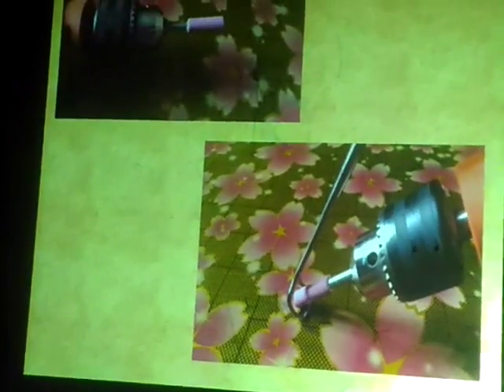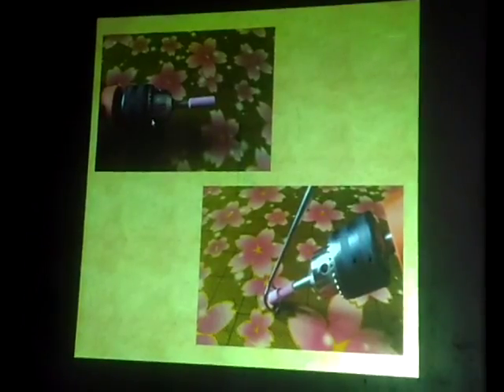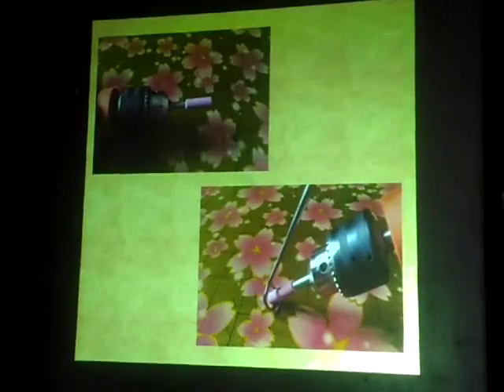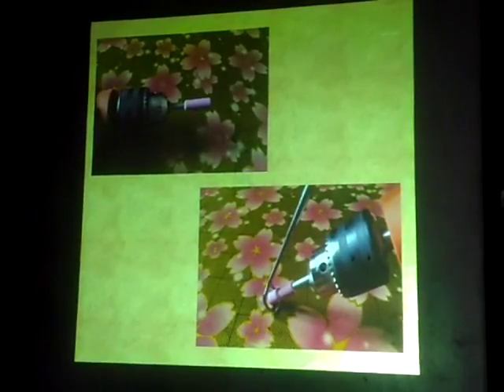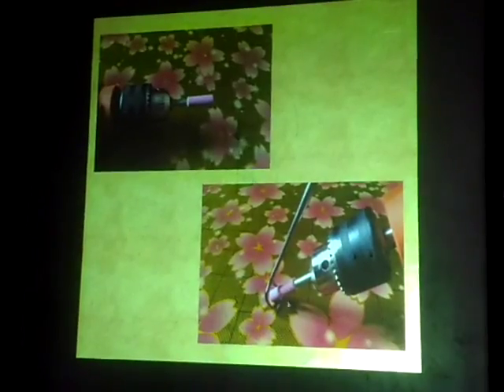But always you have to check your adenoid curette and make it sharp. You can do this with a professional, take it to somebody who can do it, or you can do it at home. You can take a hand drill that we use at home and use this kind of polish, and then you can polish your adenoid curette by yourself so that you can make it sharp.